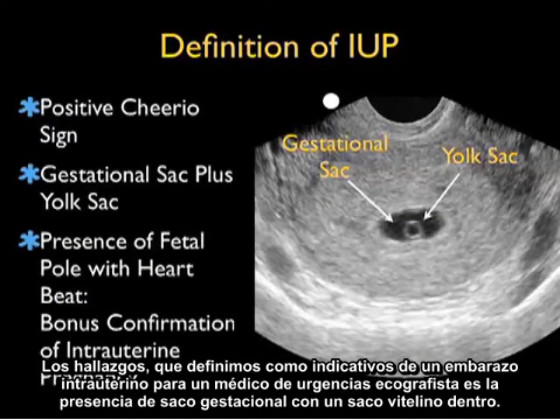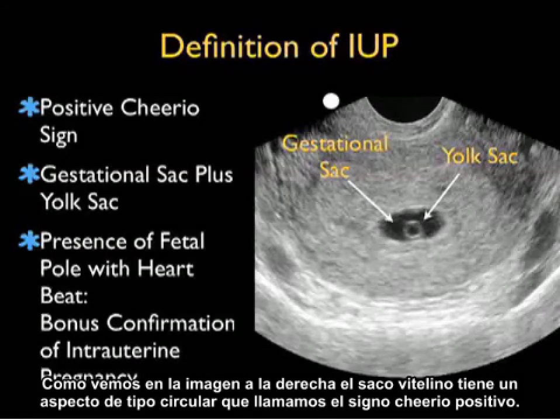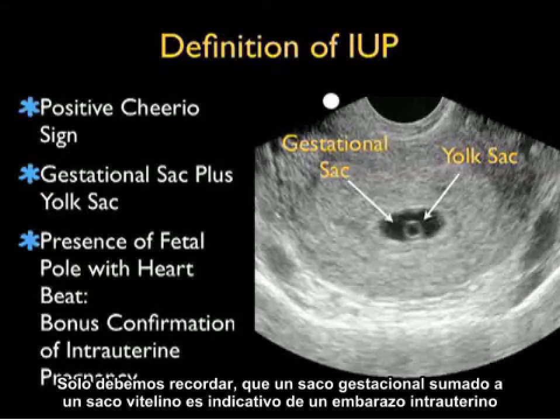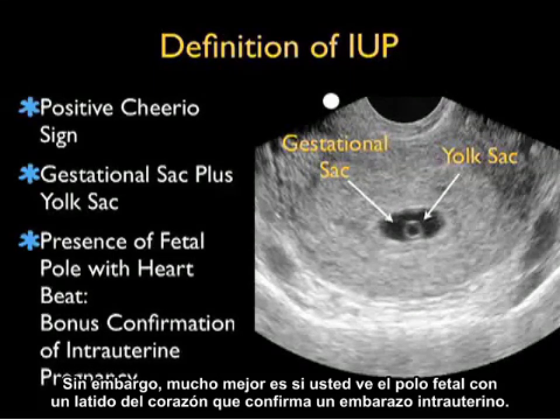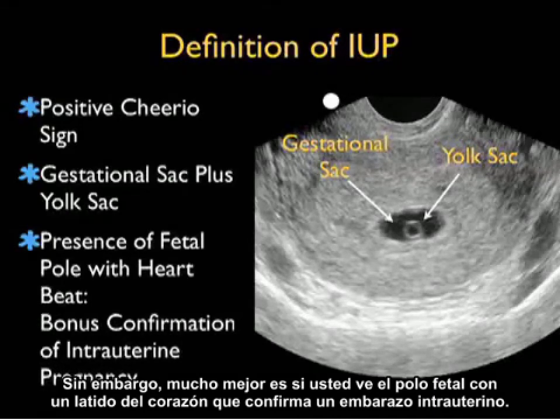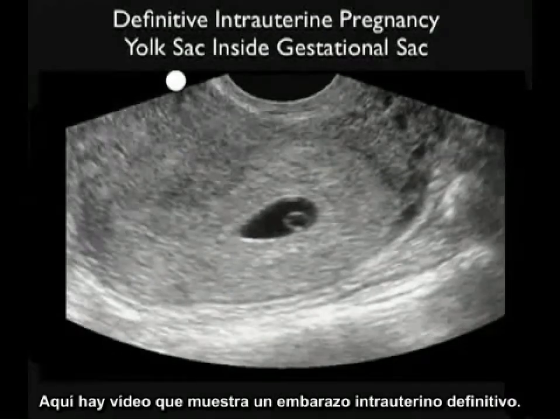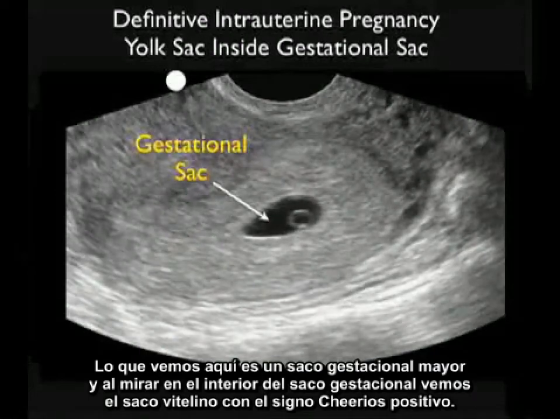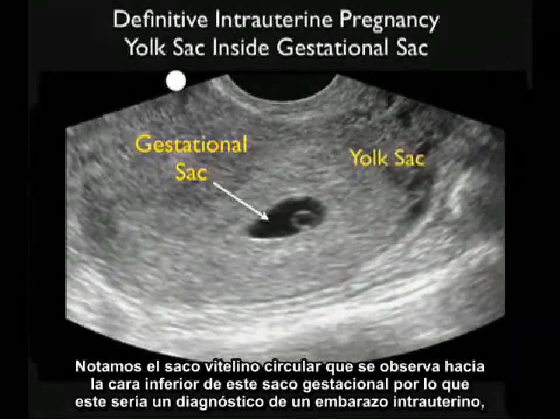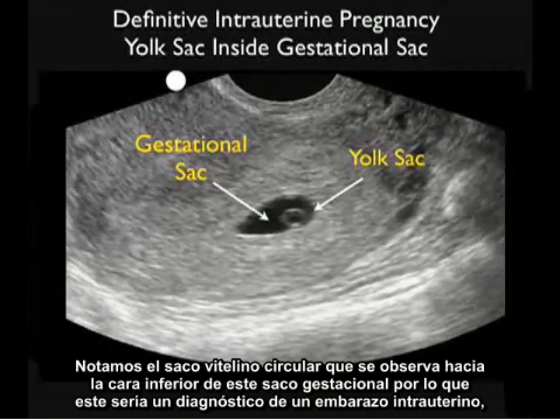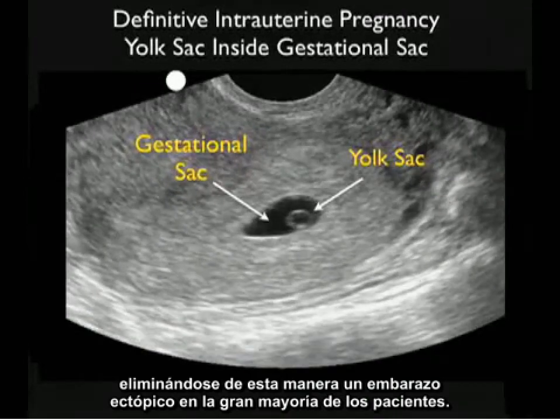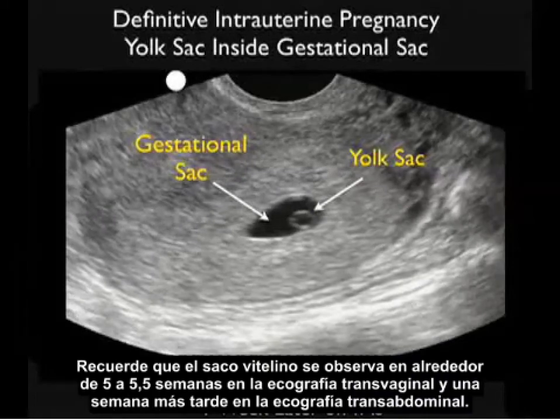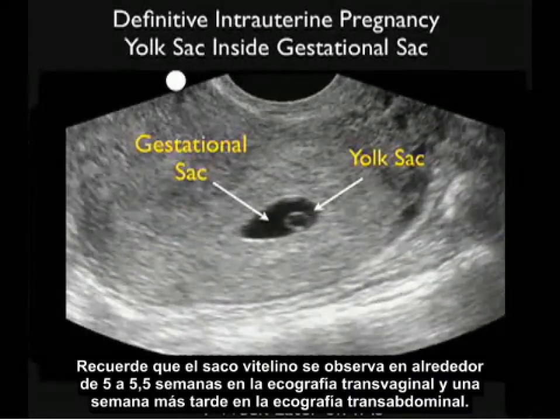The findings we define as indicative of an intrauterine pregnancy for an emergency physician sonographer are the presence of a gestational sac with a yolk sac inside. The yolk sac has a circular appearance we call the positive cheerio sign. So: gestational sac plus yolk sac is indicative of intrauterine pregnancy. Bonus points are given if you also see a fetal pole with a heartbeat. Here's a video clip showing a definitive intrauterine pregnancy — a larger gestational sac with the positive yolk sac or cheerio sign visible, effectively ruling out ectopic pregnancy in the vast majority of patients. The yolk sac is seen at about 5 to 5.5 weeks on transvaginal sonography and about a week later transabdominally.